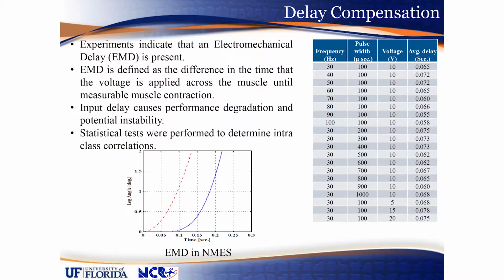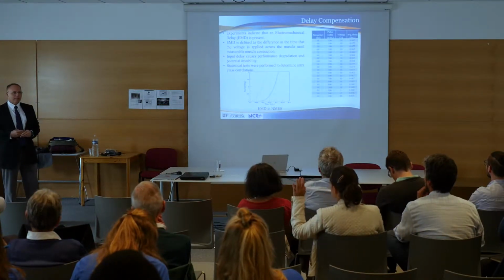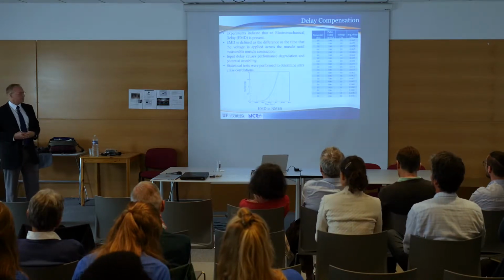So the first example that I want to talk about is the delay compensation. We did a number of experiments in my lab where we varied frequency, we varied the pulse width, we varied the voltage, and across those different parameters we saw that really the delay varied from 50 milliseconds to 80 milliseconds within that band, in all the individuals, independent of the different parameters. And so this is a nice example of where, healthy individuals, right? These are healthy individuals. And this was not fatigued. This was just the initial delay response.